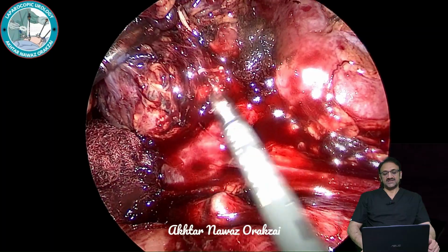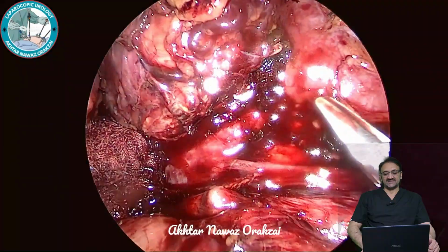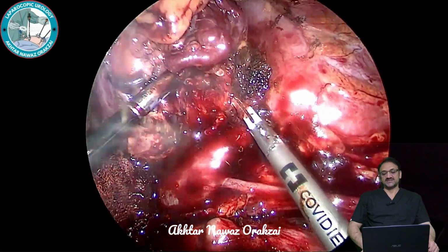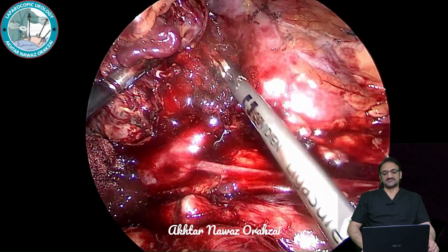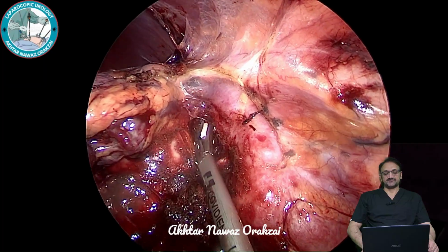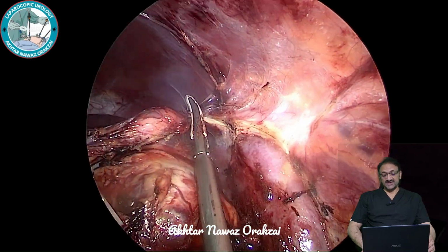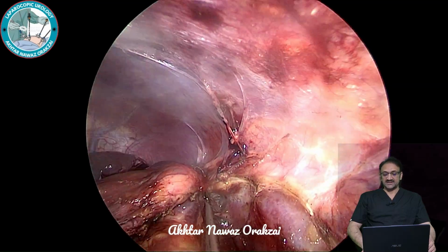But now you will see that after cutting it, since the vein was so big that we could not completely cover it, I'm using the LigaSure, and you can already see the engorgement of the veins over the gland, and this can lead to dislodgement of the clip because of the pressure, or because of the manipulation of the gland. The clip may dislodge and it will start bleeding.